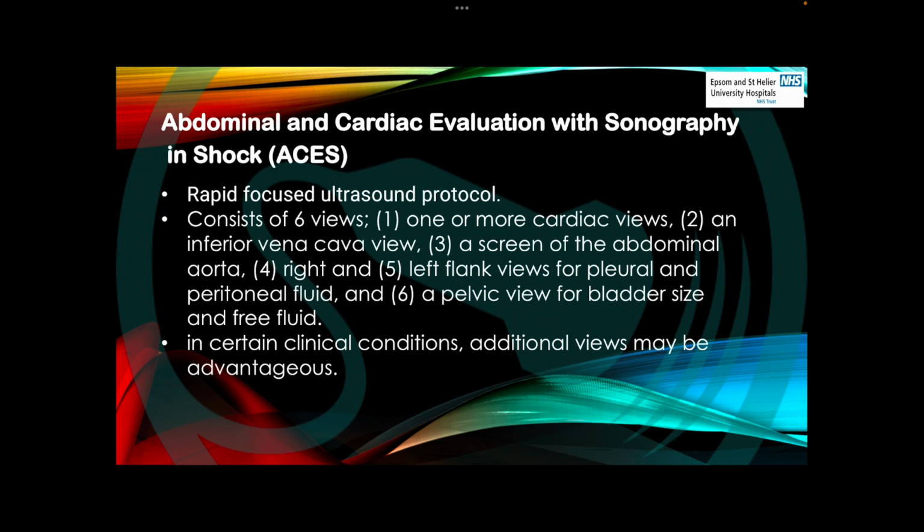We have to find out what the views are. As I said, it consists of 6 views: 1 or more cardiac views, inferior vena cava, screen of the abdominal aorta, right and left flank views, so it's pretty similar to the RUSH ultrasound or RUSH protocol, and the pelvic view.